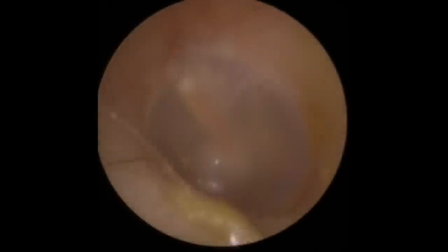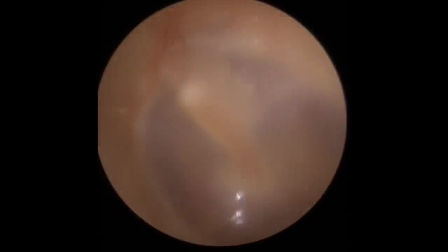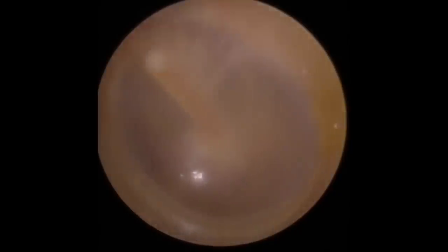So there we go. You can see just how thin that piece is. By resting against the eardrum, that would have stopped the eardrum from vibrating very well. And now there you can see our little light reflex there at the bottom. And the hammer bone there looking really good. It's all nice and healthy.